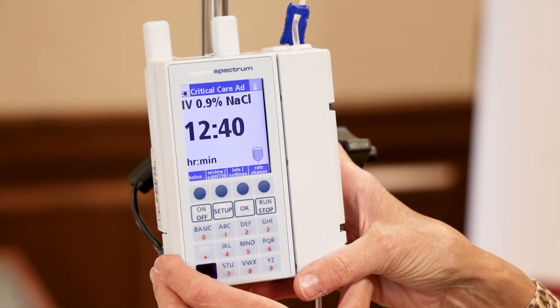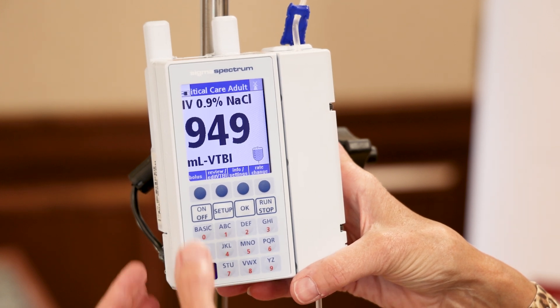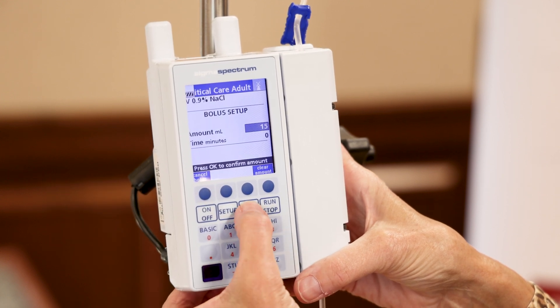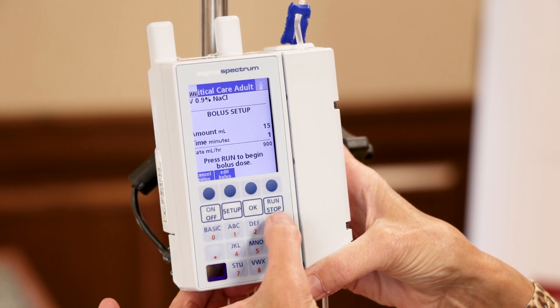So now we're going to program a bolus, and I'm going to manipulate the numbers just so that you can see what happens when it's completed. I'll use the soft key to highlight bolus. I'm going to do a bolus of 15 mLs over one minute, and press run.